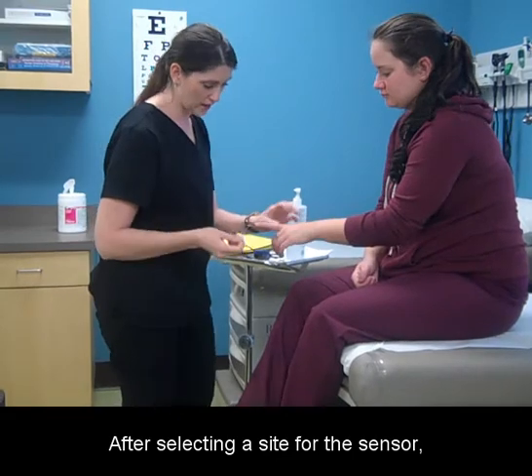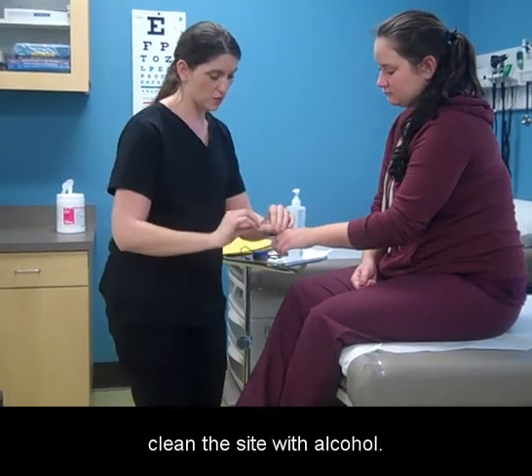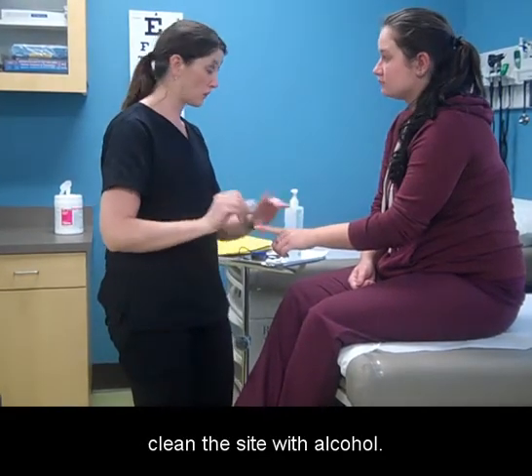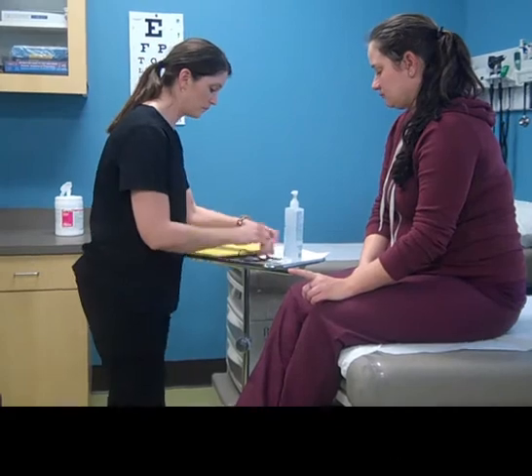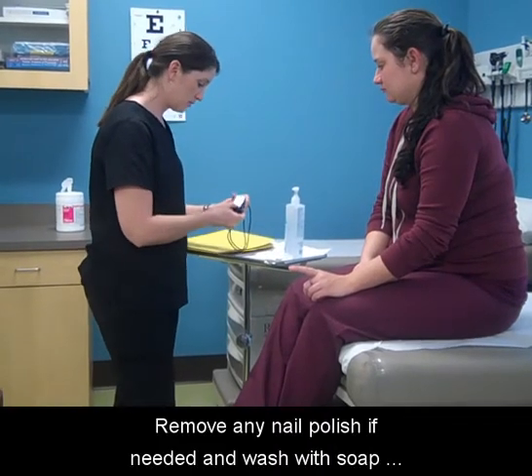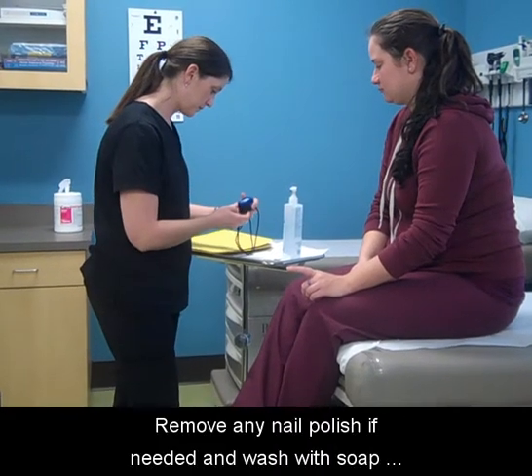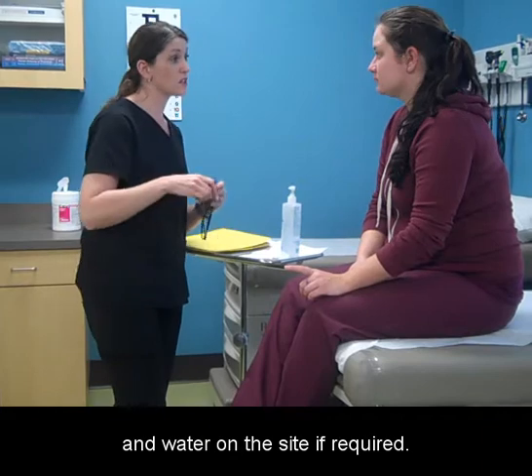After selecting a site for the sensor, clean the site with alcohol. Remove any nail polish if needed and wash the site with soap and water if required.